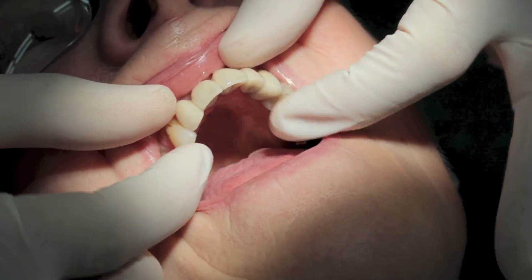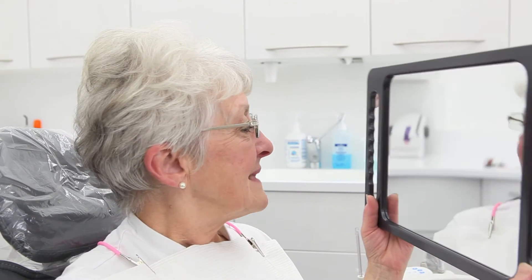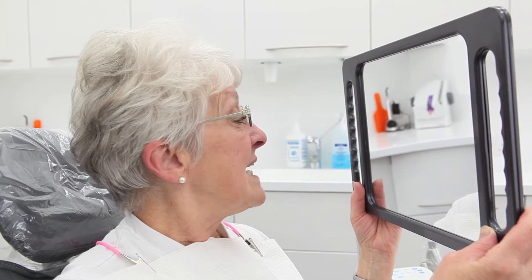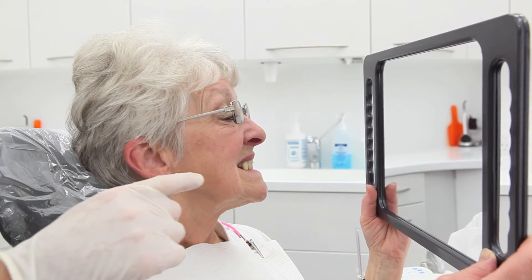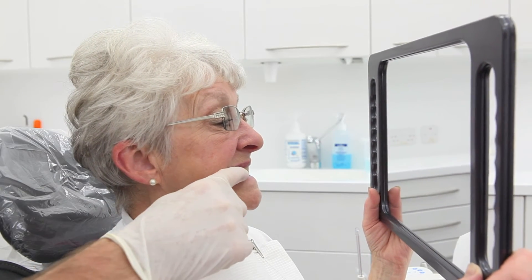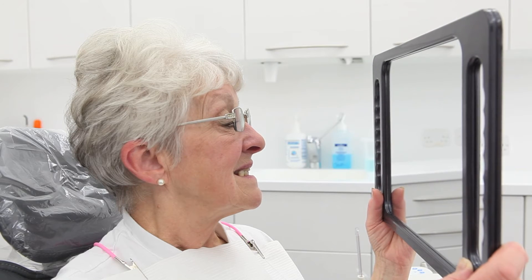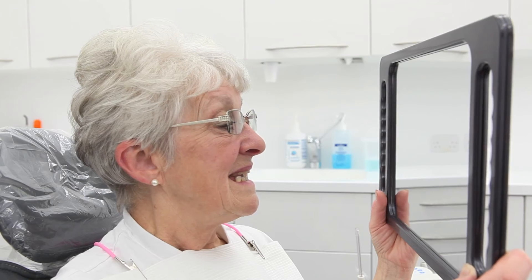Now we've attached the teeth — would you like to have a look at them? Oh, that's lovely — lovely colour, nice shape. Yes, I think he's done a good job with the colour. Now the one area we will look at again in a month's time is these lower teeth — we've spoken about possibly reducing them in height. That will be easily done and we can attend to that next time if that's what you want.